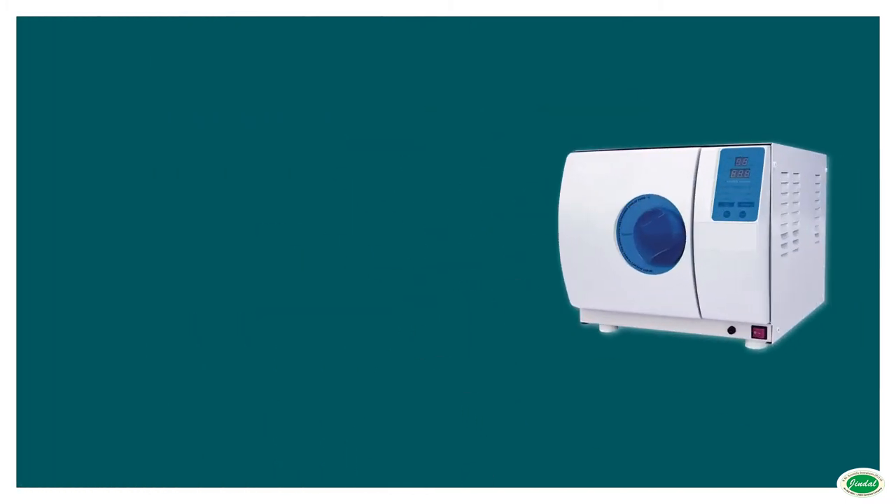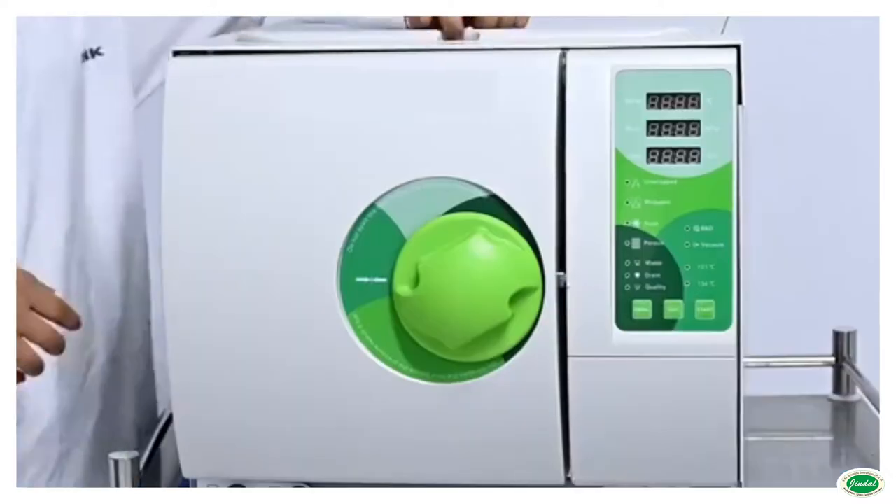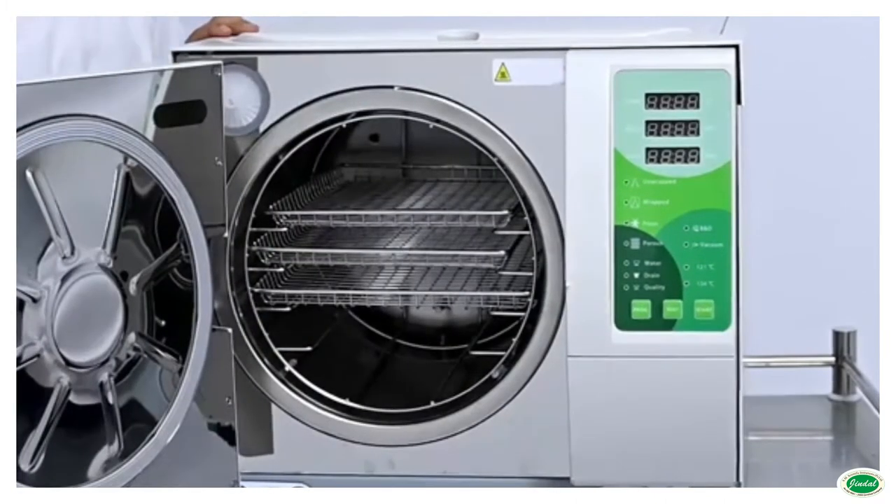Jindal High Pressure Electrically Heated Flash Sterilizer is designed to meet the requirements of dental clinics, microbiology, medicine, veterinary science, prosthetics, etc.